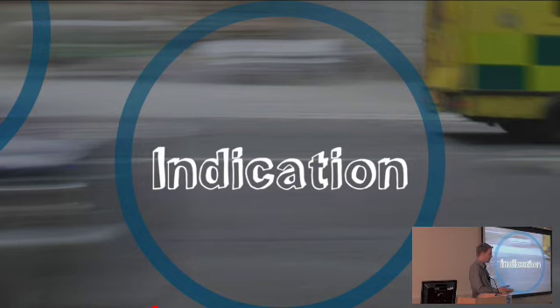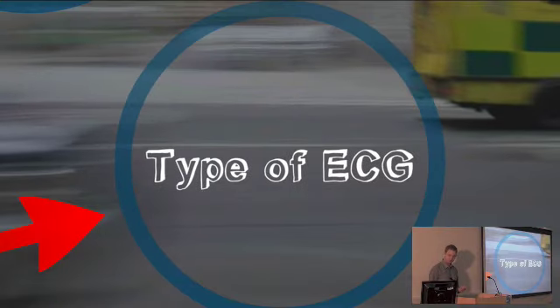If you see ST elevation in someone with acute chest pain, well, you're really thinking that might be a myocardial infarction. Whereas in someone who's sat up in a GP surgery having a routine checkup, ST elevation is far less likely to be a myocardial infarction. So you really need to know a bit about the clinical context, what's the indication for the ECG. So patient details and indication.